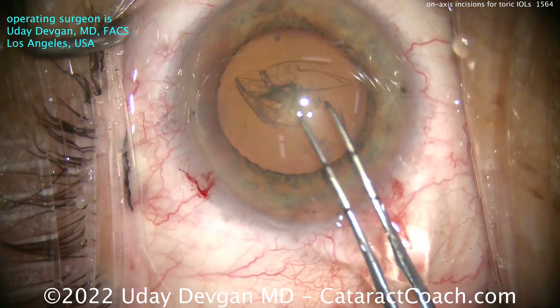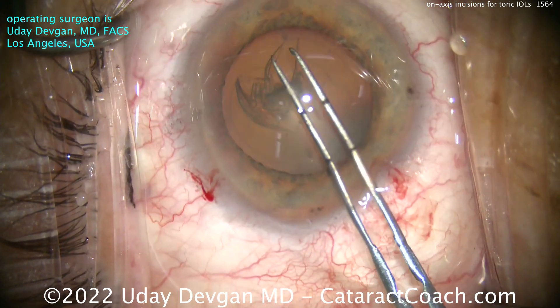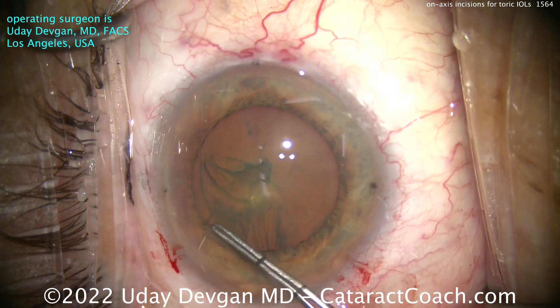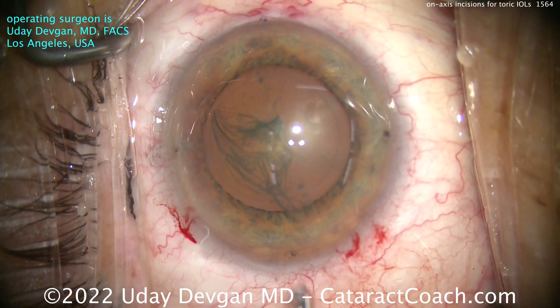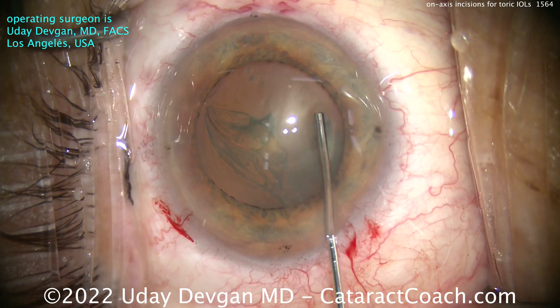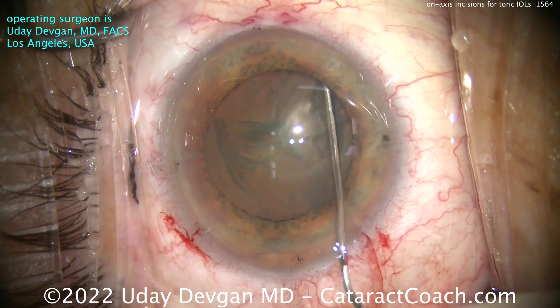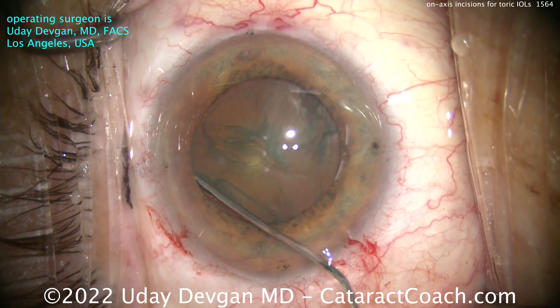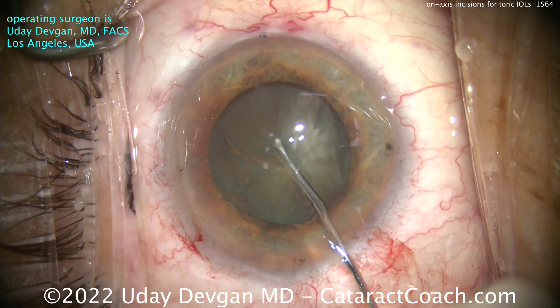So because astigmatism has both magnitude and direction, you have to take both into account. You have to add or subtract vectors in a specific way — you learned this back when you were 12 years old in math class. Because I'm making the incision on that same steep meridian or axis, my incision will cause some astigmatic flattening, but it will not cause a change in the axis.